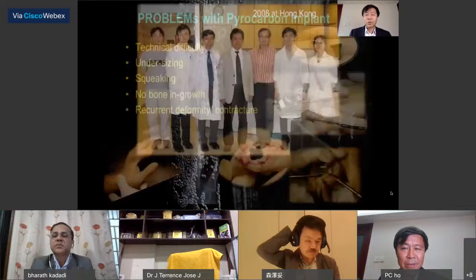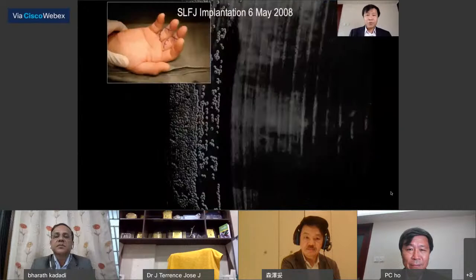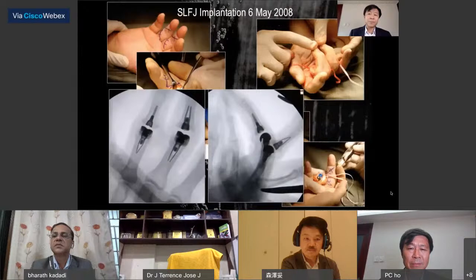So I took this opportunity to invite Dr. Minamikawa to Hong Kong to solve the patient's problem. He worked with my team and did a very nice surgery and fixed the problem of this patient. He used the volar approach and taught me how to explore the PIPJ by reflecting the tendon sheath, then inserting the joint anchor and putting in the implant. There was a very nice range of movement, stability, and a beautiful experience. The patient is happy and our team is also happy.